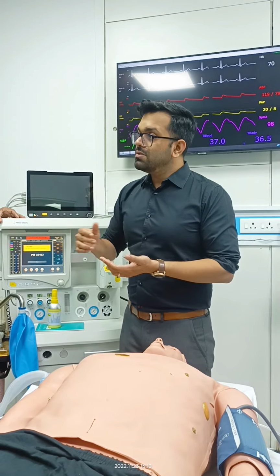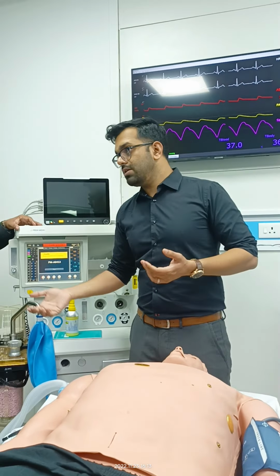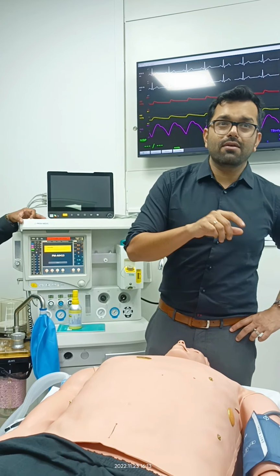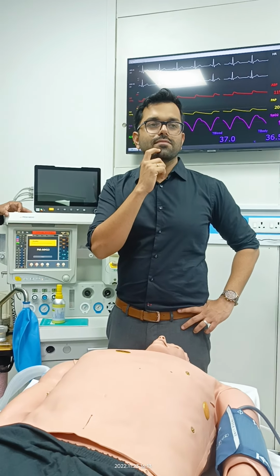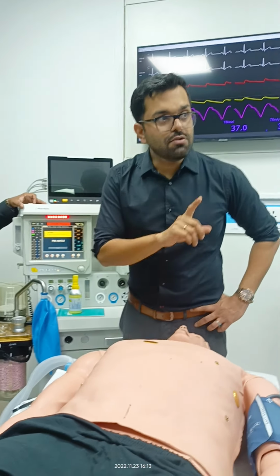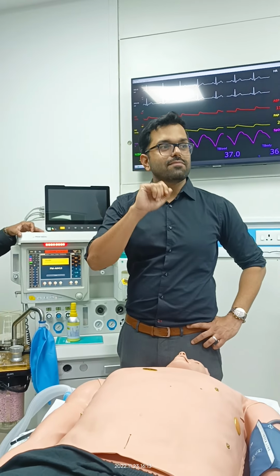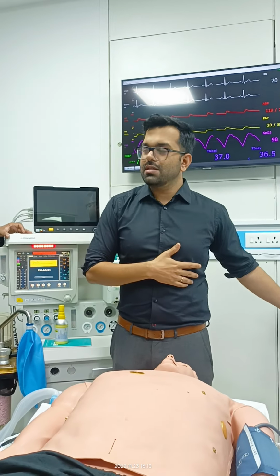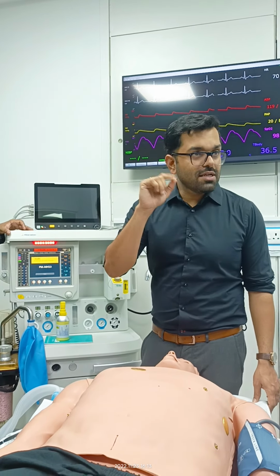Back in the days, we were also using nitrous oxide for dilution. So 40% oxygen, 60% nitrous oxide. This used to be the common combination. But what is the half-life of nitrous oxide? It's very high, more than 100 years. That means the first anesthetist who used nitrous oxide, that agent is still there in the atmosphere. The history of anesthesia is, I think, 1910, 1950s, I forgot. The story is very interesting, read about it.